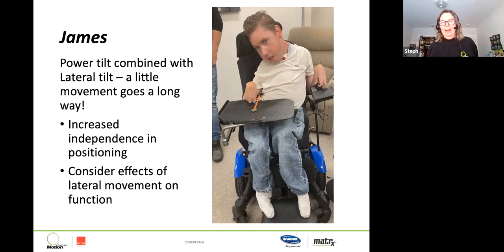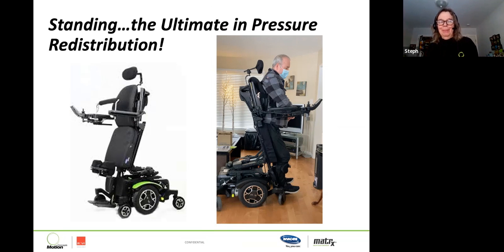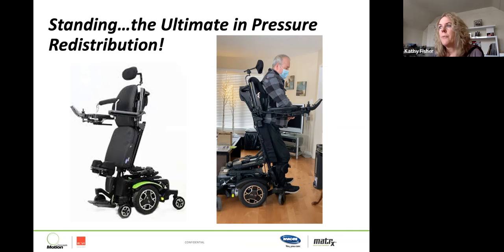Yeah. And I know we're going to be crunched on time, but somebody just asked what was the funding source for that, and I put it in the chat box. I know we probably have done several dozen of these over the last few years for the US market, and I've got some great suggestions about how you can go about trying this and funding it if you're asking for the US. Kathy's in Ontario. Yeah, and unfortunately in Ontario, there is no funding for lateral tilt. There's funding for anterior posterior tilt. But he was able to get some funding through the Muscular Dystrophy Association. And he's one of 8 kids.